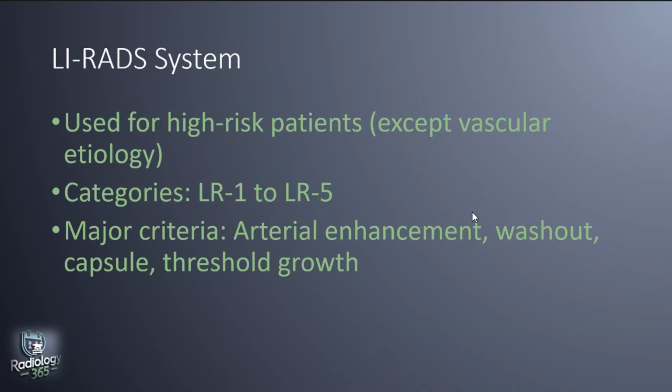The Liver Imaging Reporting and Data System, LI-RADS, was developed to standardize reporting in patients at high risk for HCC. It helps reduce variability and improves communication between radiologists and referring physicians. It categorizes lesions from LI-RADS 1, that's definitely benign, to LI-RADS 5, definitely HCC.